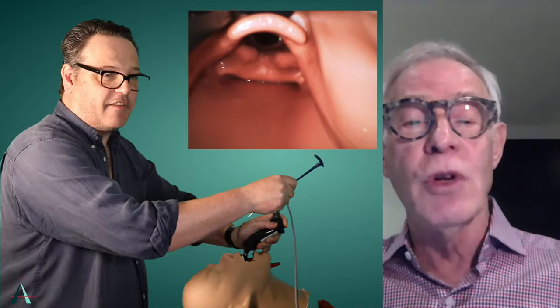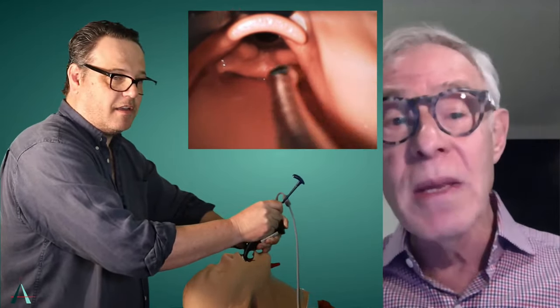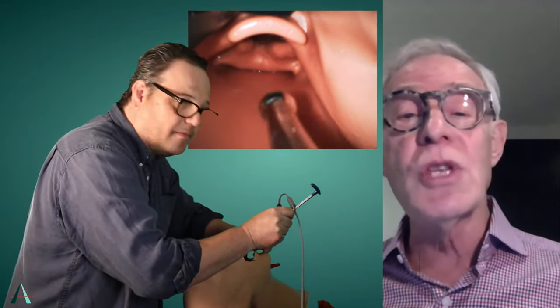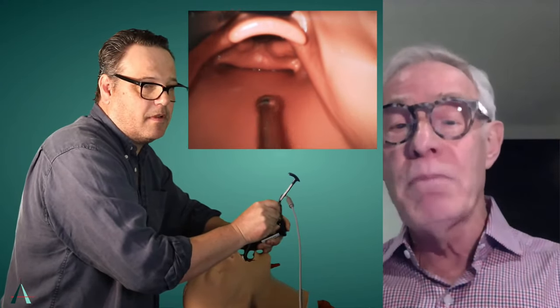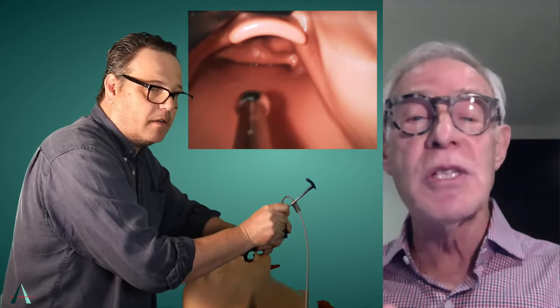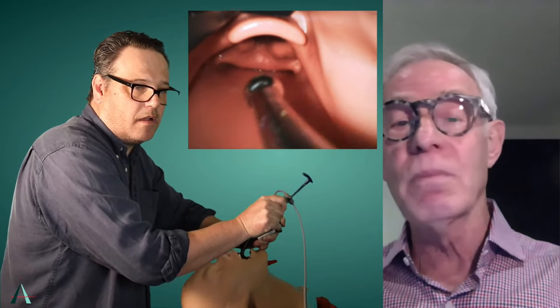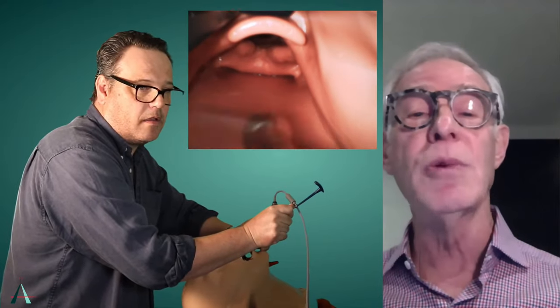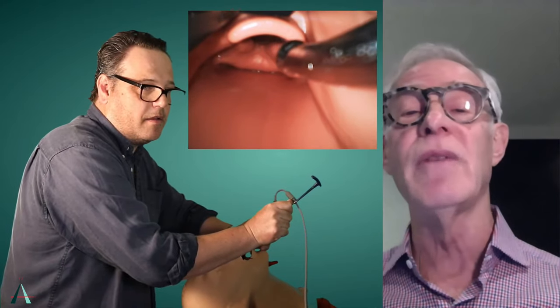Now let's take the stylet end. I've just got the stylet for the moment. Okay, now insert that, looking in the mouth, not on the screen. Okay, now watch the advance. Now you look at the screen and deliberately pull that back a little bit so that you're proximal to the larynx and you're right in the center with the arytenoids, right between the two arytenoids. Perfect.